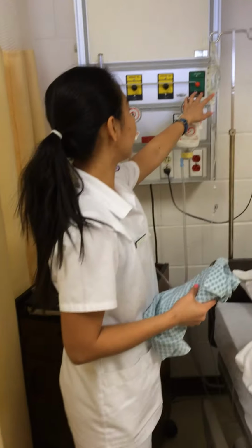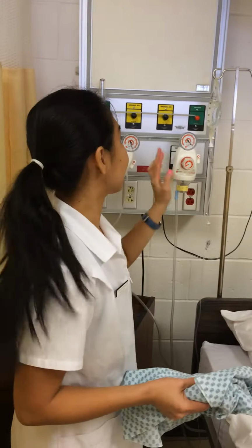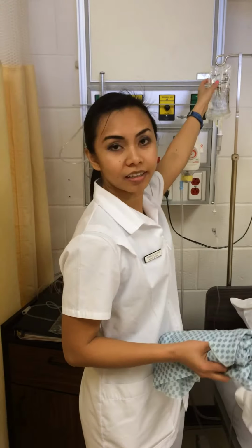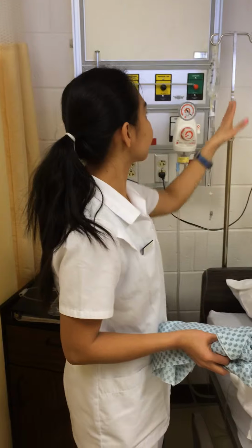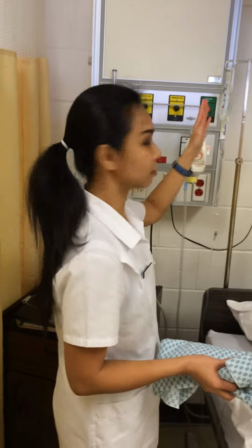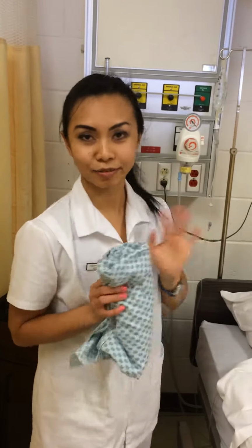Oh, I'm sorry. When I do the IVPB bag, I need to lower the primary bag down so that the IVPB bag can start to go to the patient. I just fixed that.